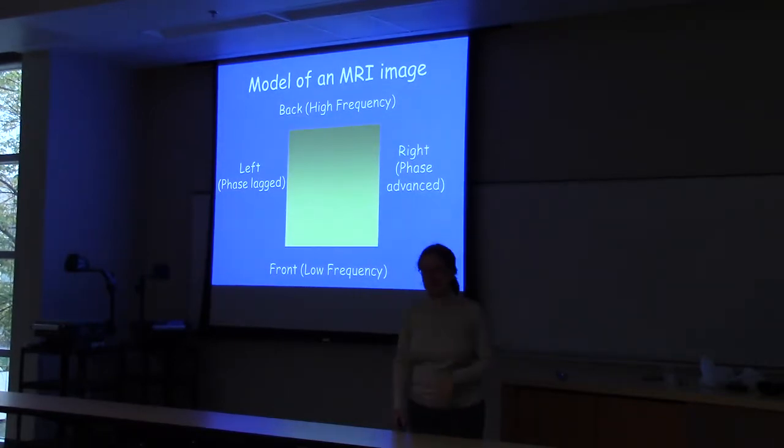Now we have a problem of left to right. So what comes here is we put on another magnetic field gradient, but this time we just put on a little pulse. So the frequency changes slightly, say lower here and faster here. And so we're just putting it on for a brief bit of time. These guys will get a phase, and these guys will get a phase, and they'll be out of phase. And based on the phase, we can figure out where they are.